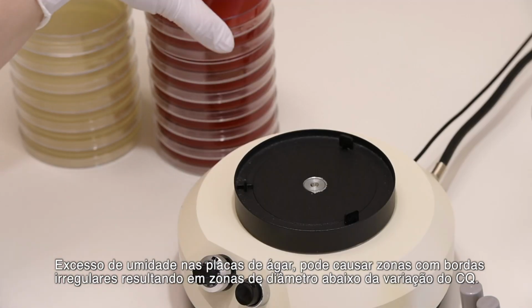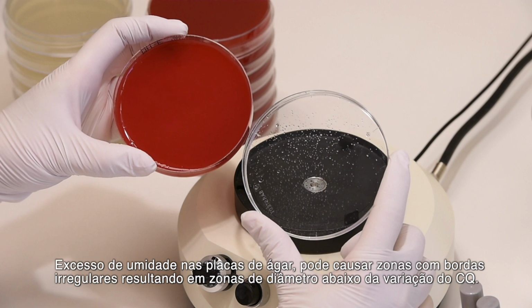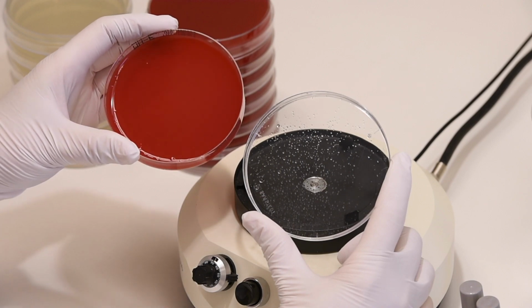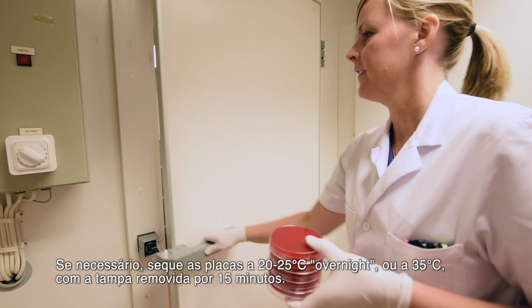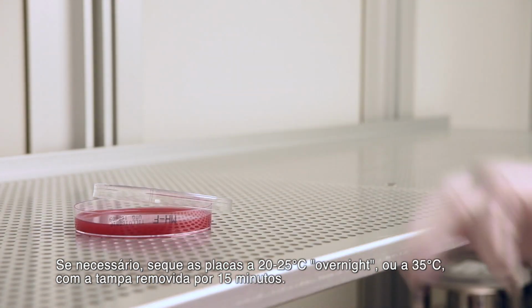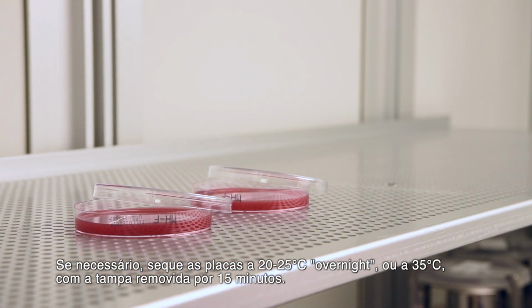Excess humidity in agar plates may cause fuzzy zone edges, resulting in zone diameters below the QC range. If necessary, dry plates either at 20 to 25 centigrade overnight or at 35 centigrade with the lid removed for 15 minutes.